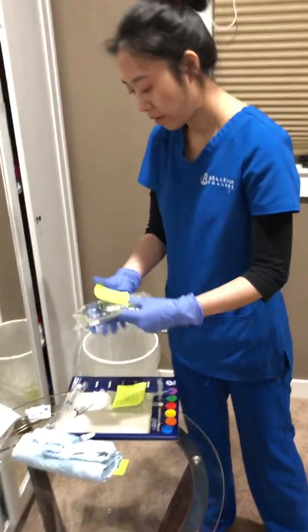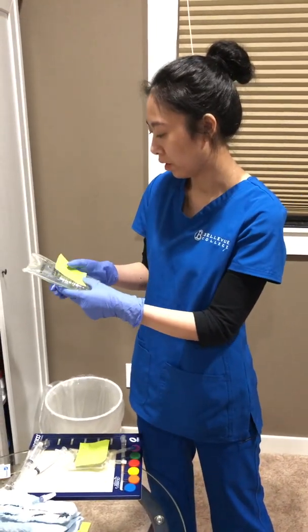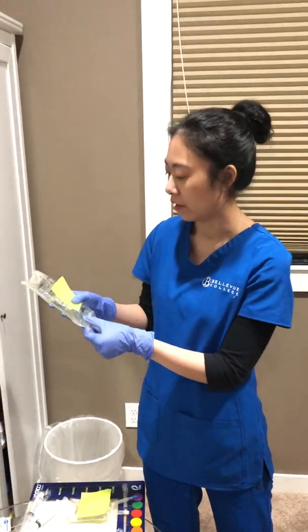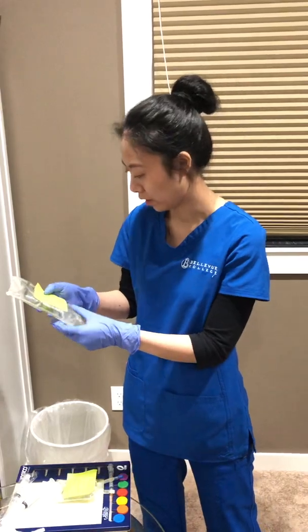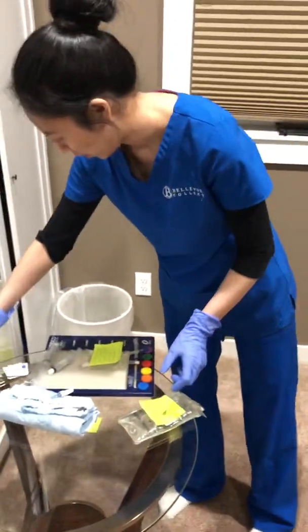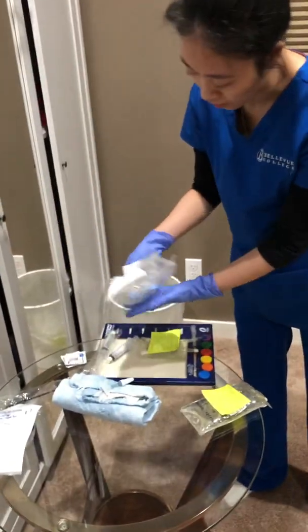So here's 1,000 milliliters of sodium chloride. I calculate the math is 21 drops per minute, and it is the right patient. Then I'm going ahead to give you, open this.